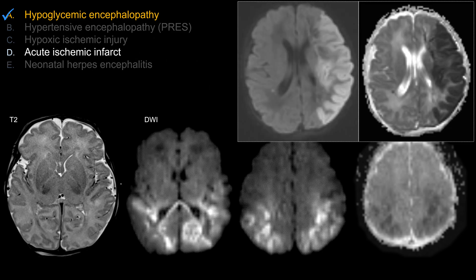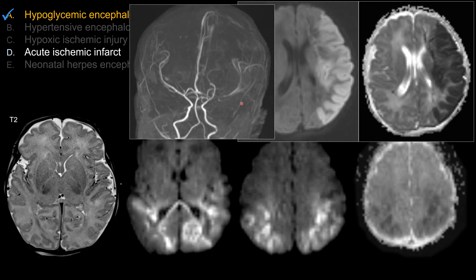For acute ischemic infarction, the territory is distinct to an arterial territory — in this case a large MCA distribution. Compared to hypoglycemic encephalopathy, the involvement here tends to involve two territories, such as posterior MCA as well as PCA. So that is different. It's also a bilateral process, which is unusual for an acute ischemic infarction due to occlusion of a vessel. In this case, there's occlusion of the MCA leading to a large territorial infarction, sparing the PCA as well as ACA territory.